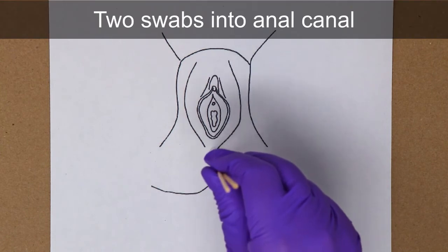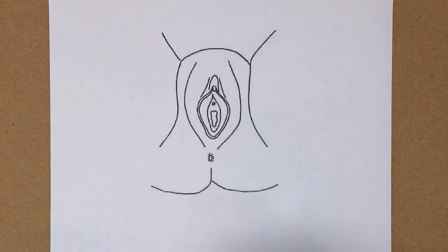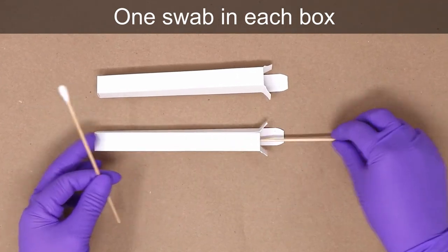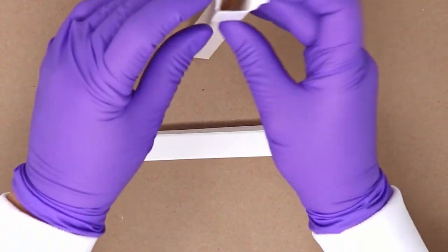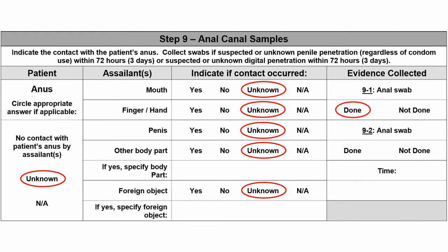2 swabs should be collected simultaneously and inserted into the anal canal. The swabs can then be placed in labeled swab boxes and sealed. The paperwork can then be completed. In this case, the nature of contact between the patient's anus and the assailant is largely unknown. As such, we will circle unknown for each of the answers to these questions. We can then circle done for each of 9-1 and 9-2, the anal swabs, and include the time collected.